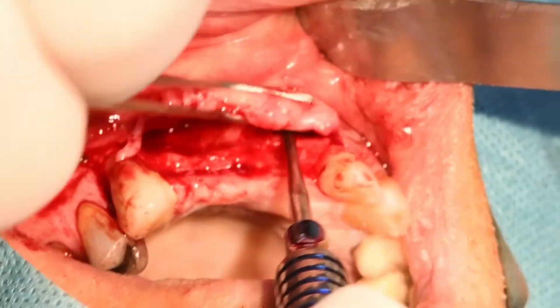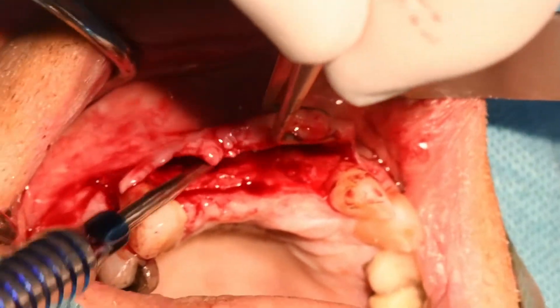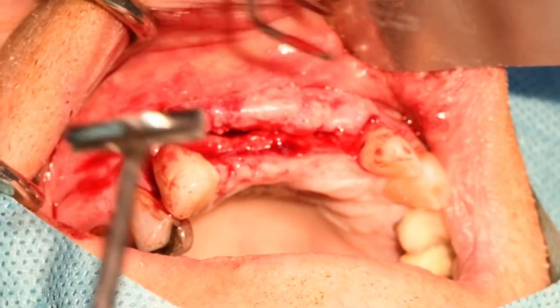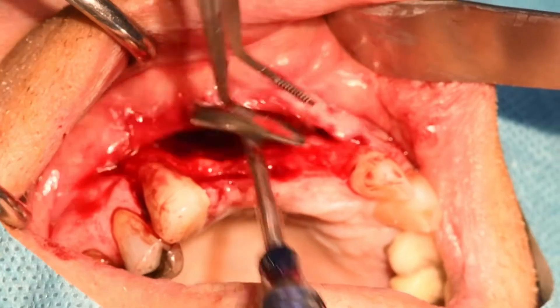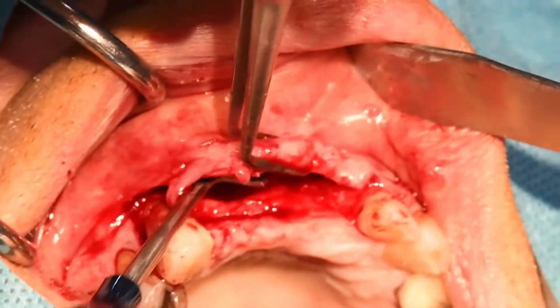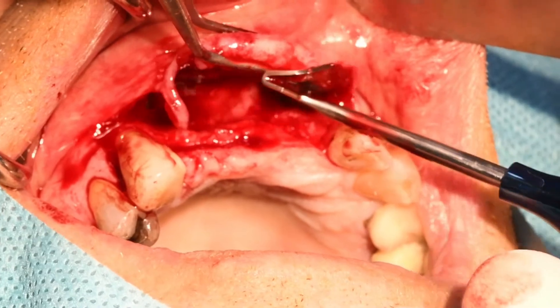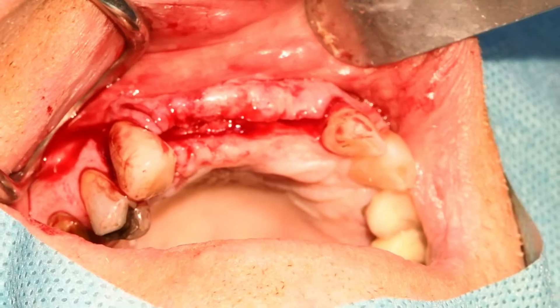La dernière fois j'avais voulu montrer comment on utilisait ces instruments, mais j'avais pas pu utiliser le plus grand. Si je peux le faire un peu plus petit ça m'arrangerait — c'est pas le plus grand, il y en a encore un plus grand, mais c'est pas la peine, c'est pas facile à utiliser. Mais c'est bien de le faire : on tire un peu sur les tissus, c'est mieux que de rompre avec le bistouri et tout flinguer, et couper la vascularisation du périoste.